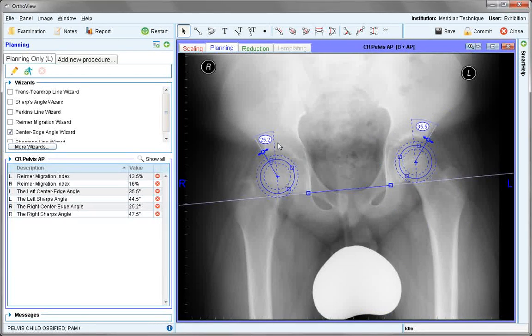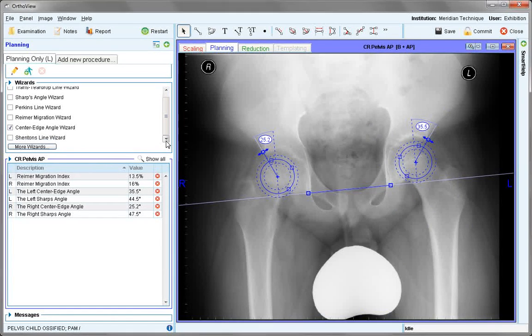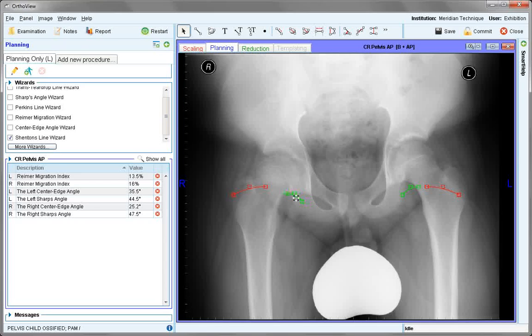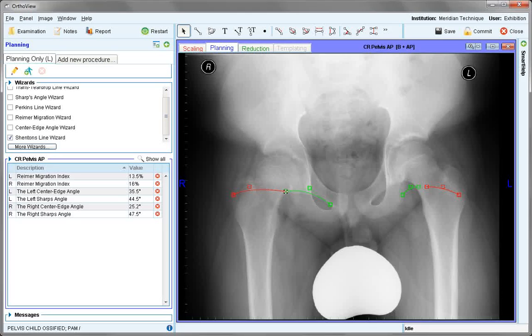Remove zoom and the measurements are again recorded. One additional wizard given in the set is Shenton's line wizard. This consists of two portions, either of which can be used together or independently. For example, on this side, using it as a combined curvature line: first position both ends of the tool, then use the centre handle to curve to the shape of the pelvis. Similarly with the red line, position first the distal components and then use the centre to make the curvature, giving a visual representation of the curve.